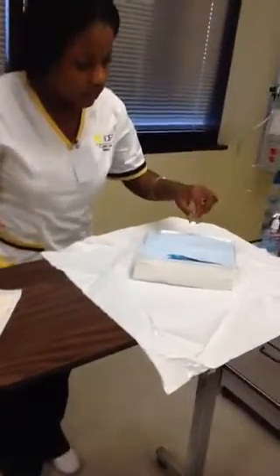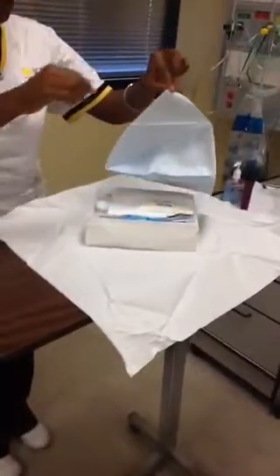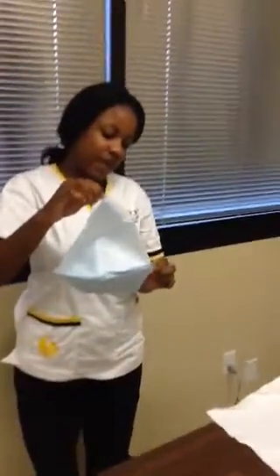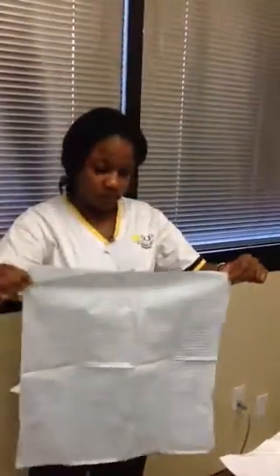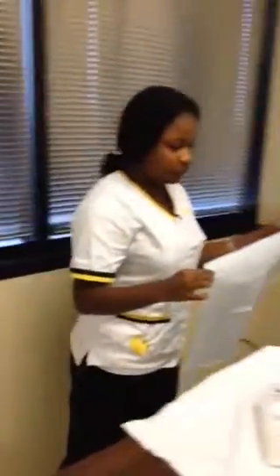So now I'm going to take the blue sheet, step back. I will make sure that I only touch the 1 inch margin. Step back. And then now I'll take it to the patient room.